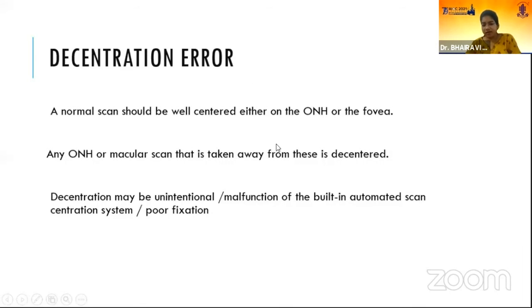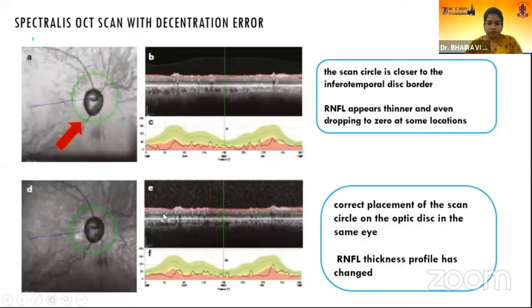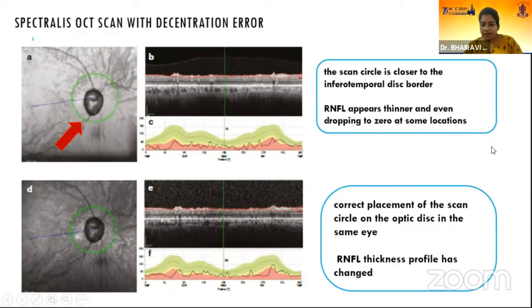A normal scan should be well centered either on the ONH or the fovea. Any scan taken away from these locations is called a decentered scan, which may be unintentional, due to malfunction of the built-in automated scan centration system, or poor fixation. In this Spectralis OCT scan showing decentration error, the scan circle is closer to the inferotemporal disk border, so the RNFL will appear thinner and may even drop to zero at some locations. With correct placement of the scan circle on the optic disc in the same eye, the RNFL profile returns to normal.